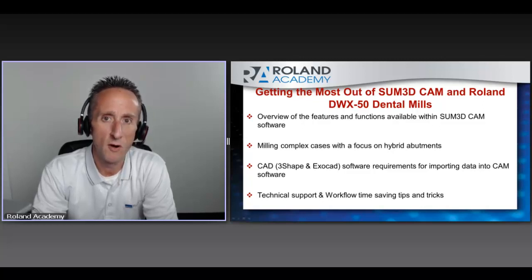Today we're going to have a partner webinar with Mike Webb from CIMsystem, or SUM3D as most of you know. This one is going to be covering getting the most out of your SUM3D CAM and the Roland DWX50.